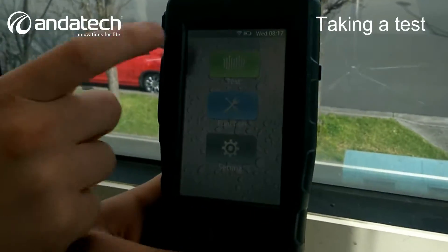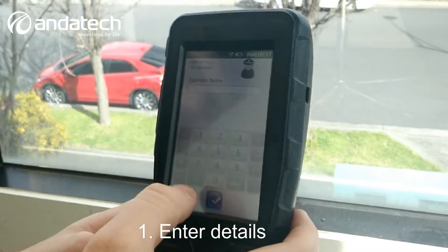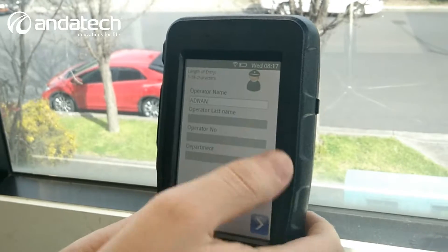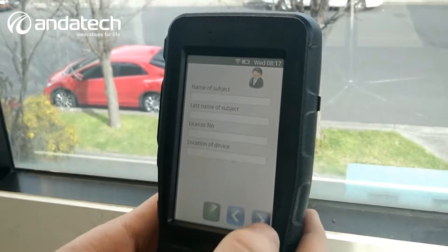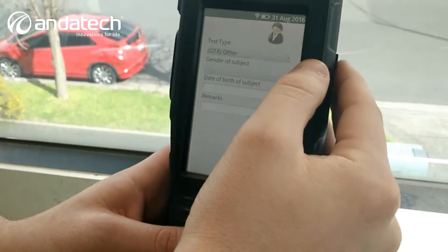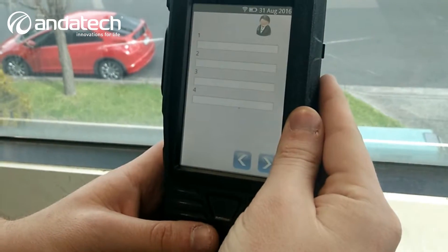Easy way to do the test — simply press the test button and enter the operator's name. Everything else can also be accepted in the settings menu. Name of the subject, last name of the subject, license number, location of the device, what kind of tests you're going to be doing, and date of birth.